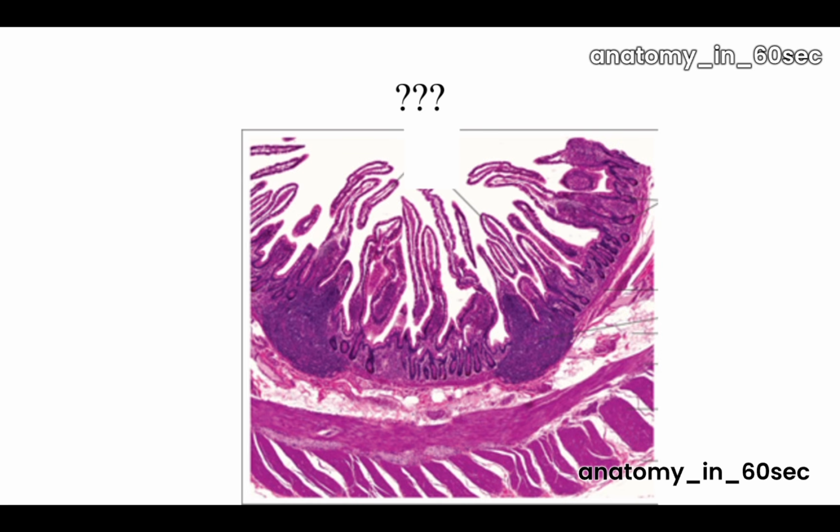Next slide, try to identify this. In the slide you can have villi seen. So these are the finger-like projections that are seen. Beneath these villi இங்க என்ன இருக்கு? There are some aggregations which are present. So this is the key identifying feature of the slide.